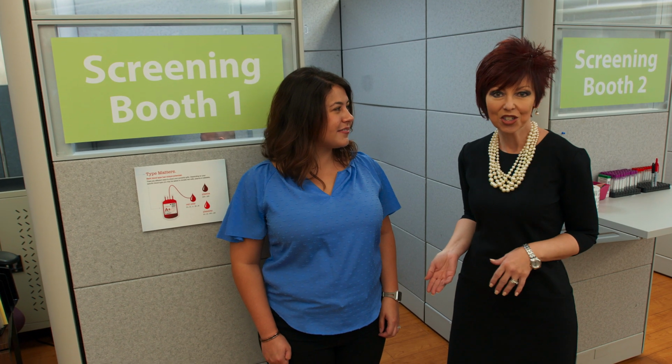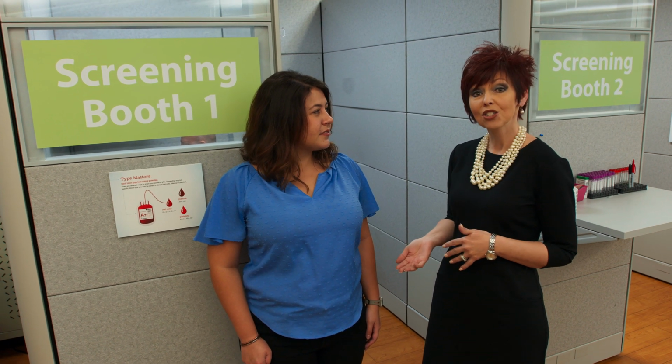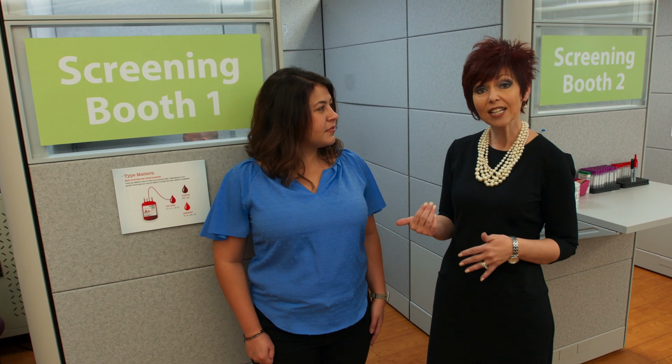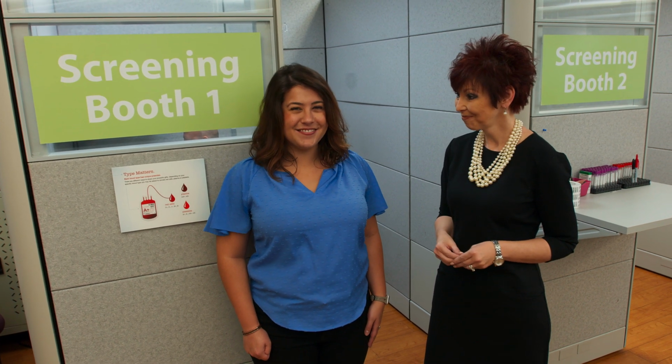At this point in the donation process, Kara's going to enter our screening booth. Kenny, our phlebotomist, is going to go through her questionnaire. He's also going to do a very brief mini physical. Kara, are you ready? I am ready. Okay. All right.